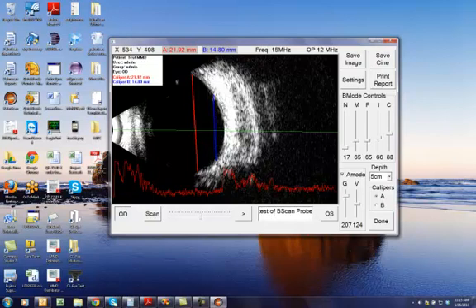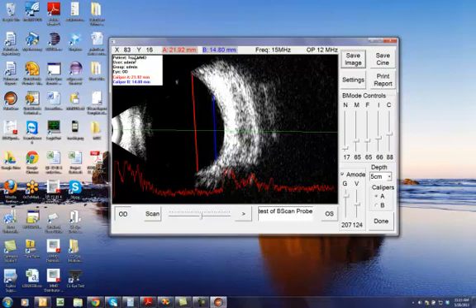And at this point, I'm going to save this particular image. Because we had assigned a patient name, it automatically saves the image under that patient.